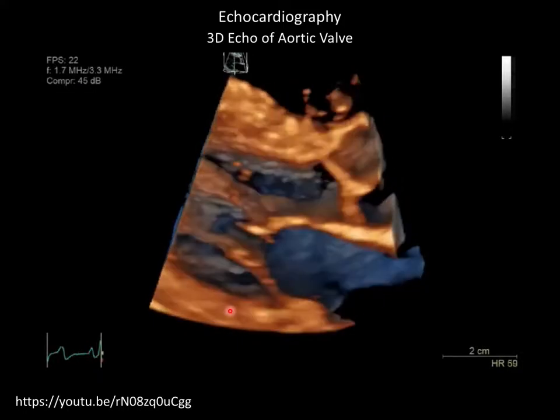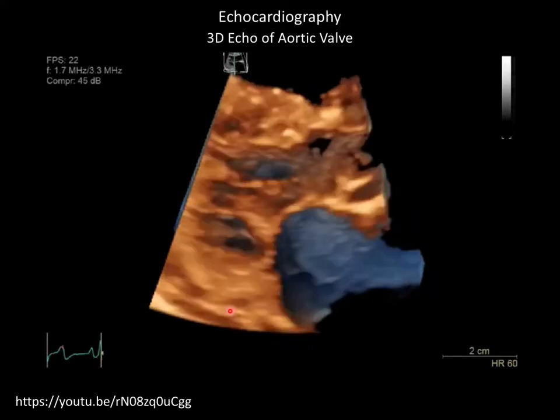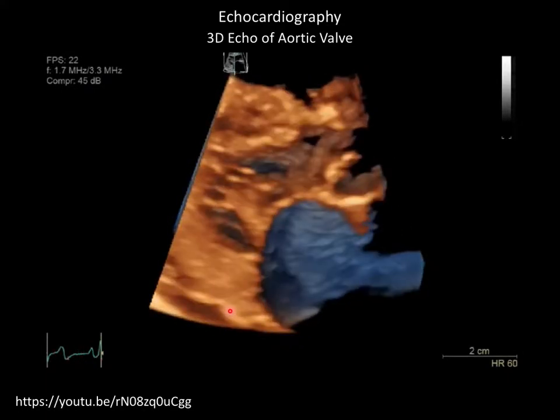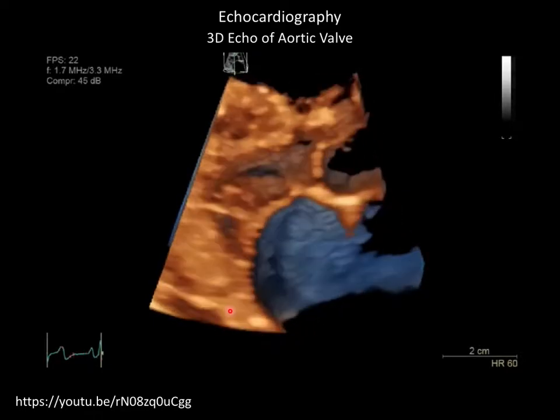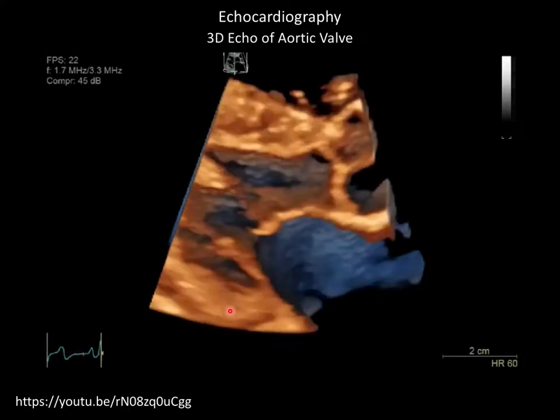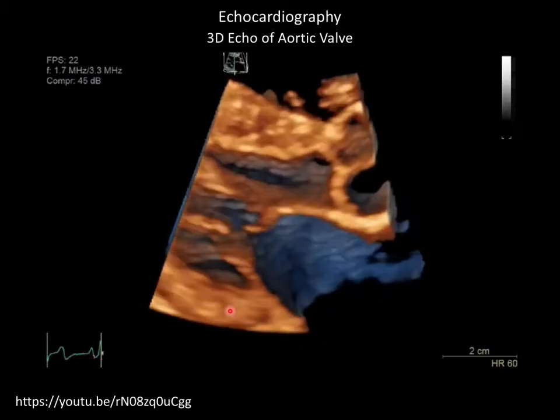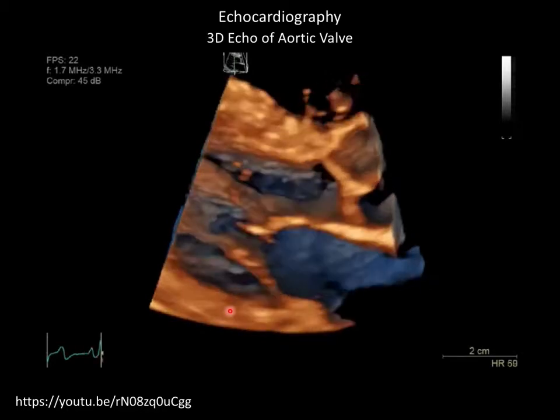you could. So instead of using, remember that 1.5D transducer that had a set of elements along the azimuthal direction as well as in the elevation direction? You could probably excite 2 slices simultaneously, or 3 or something like that, using that array, right?